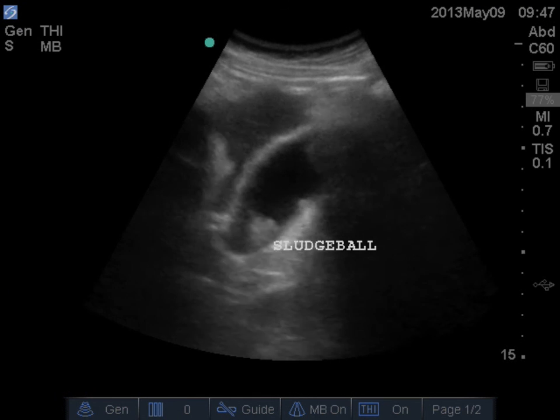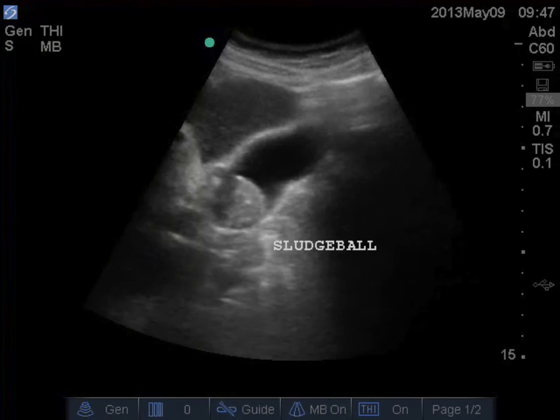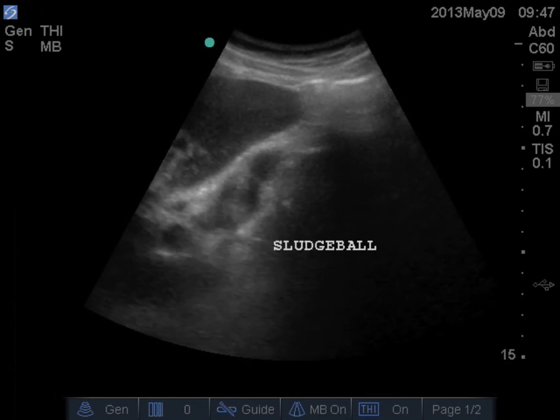This is a clip of the ever-elusive sludge ball, the evil and dangerous half-brother of dodgeball. I know, for the record, some of these jokes are only for my benefit. Thank you for playing along.